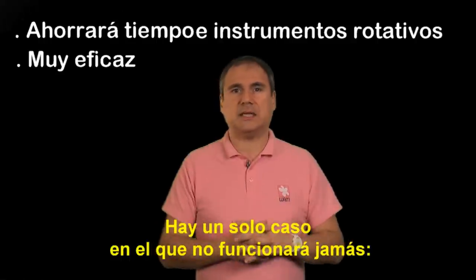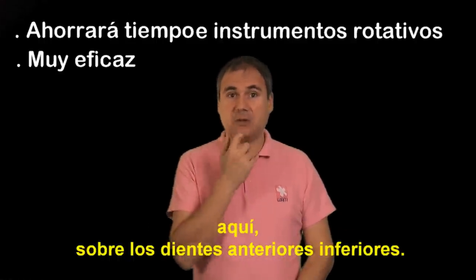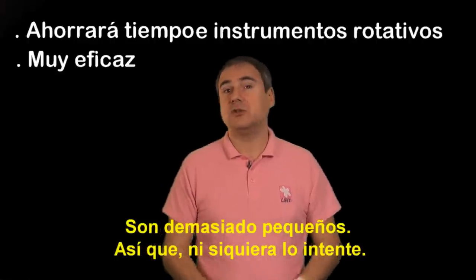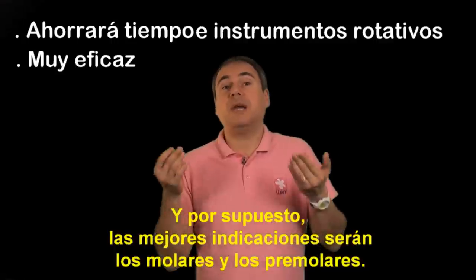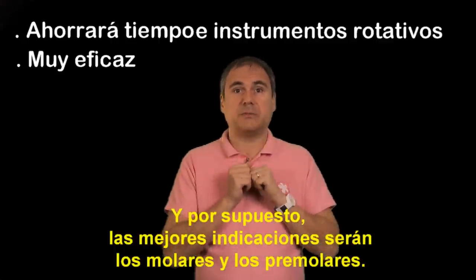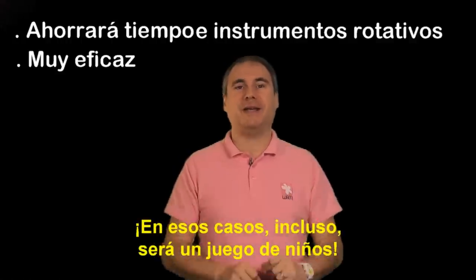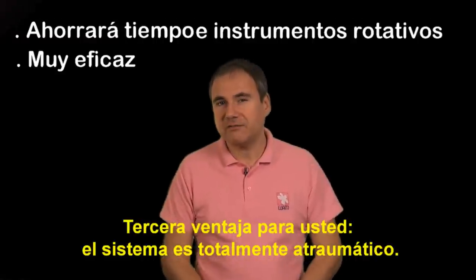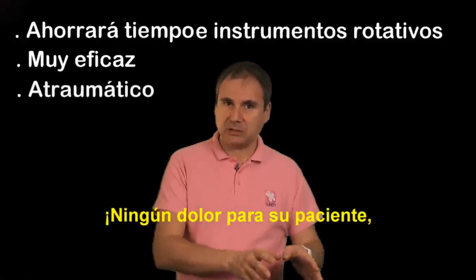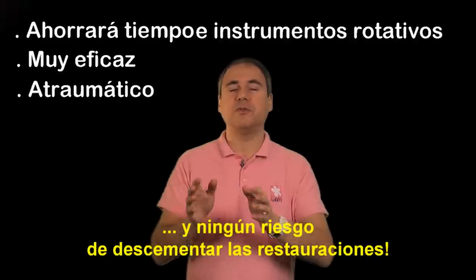There is only one case where it will never work: the lower anteriors. They are too small, so don't even try it. The best indications are molars and premolars — in those cases it will be a child's play. Third advantage: it's extremely gentle. No discomfort for your patient, no risk for the supporting tooth, no risk of removing the build-up.